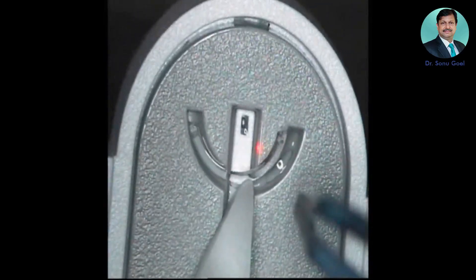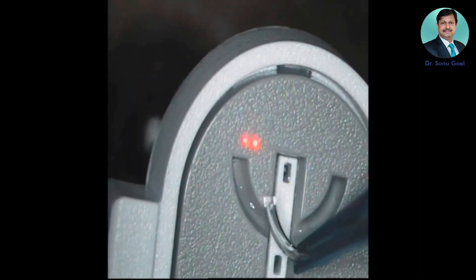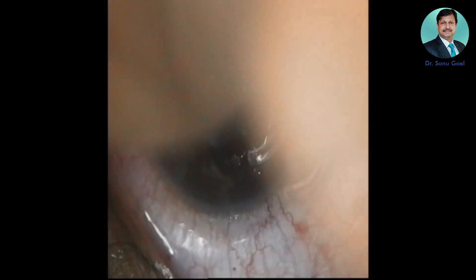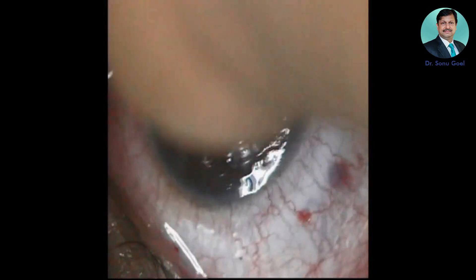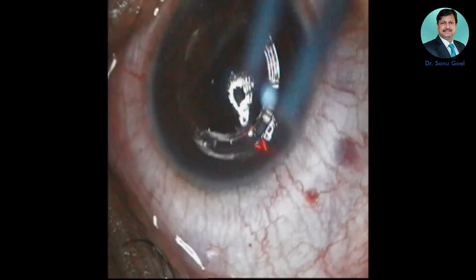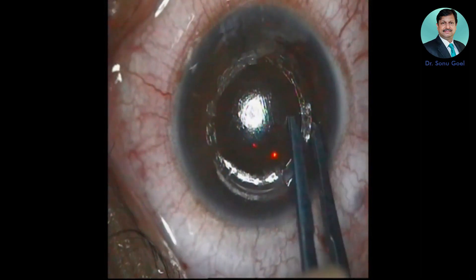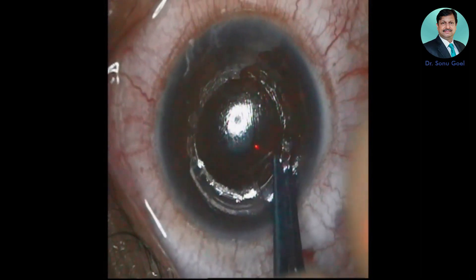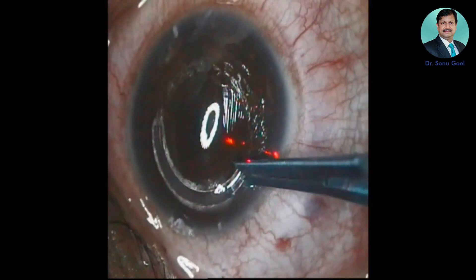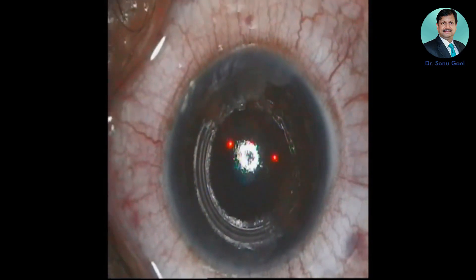A drop of Vegamox is added. A Merocel sponge is used to dry, otherwise the intacs can slip while holding. The intacs is held and directed almost to the center very carefully. These are specially designed forceps — undue force should not be used. It should go in the right track with no false track opening, and gently glide along the direction of the tunnel.